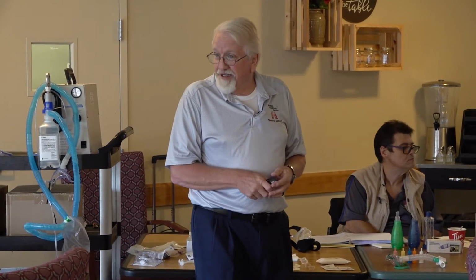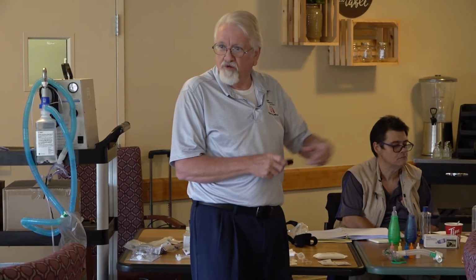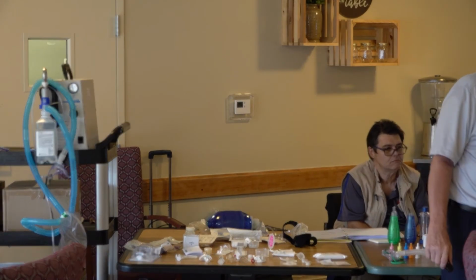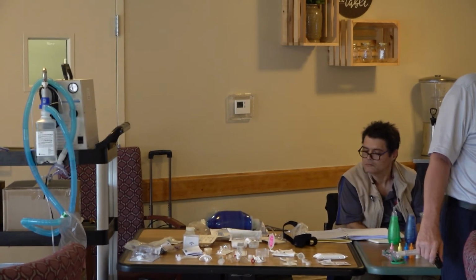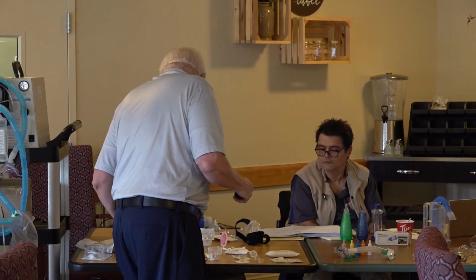Any questions about trach care or any of that kind of stuff? I would assume probably, Mary, you guys will go to the disposables as well on a regular basis. So like I said at the beginning, if you see a twist and lock, make sure you let your supervisors or whoever know, so we can make sure that we get that changed.